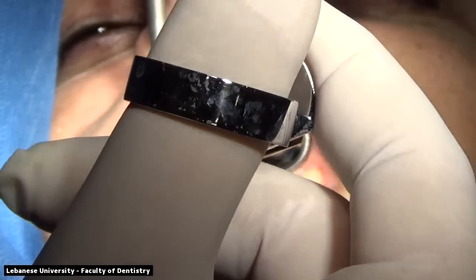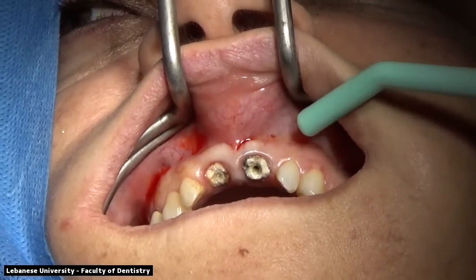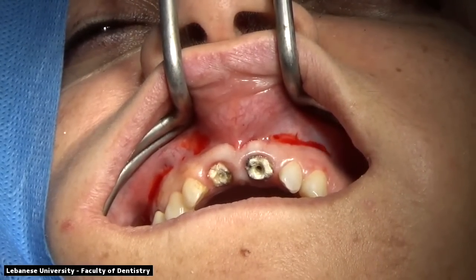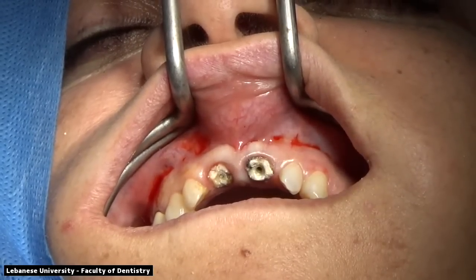Good afternoon. I would like to invite you all to attend our surgical live presentation from the Lebanese University School of Dentistry at the Perio department. We are going to present a case of anterior 2 implants in the aesthetic zone. The patient presented with a chief complaint of a fracture on the upper right central incisor.